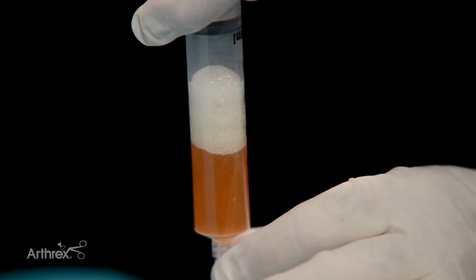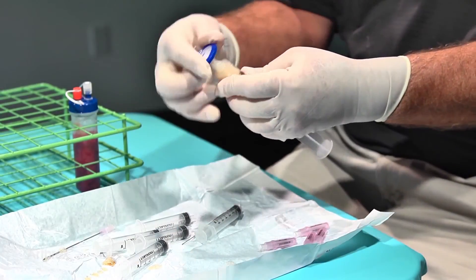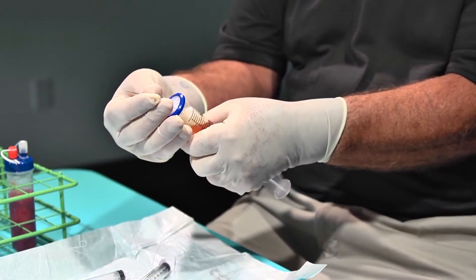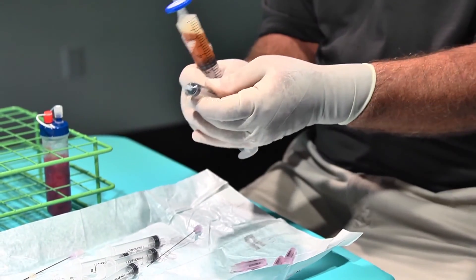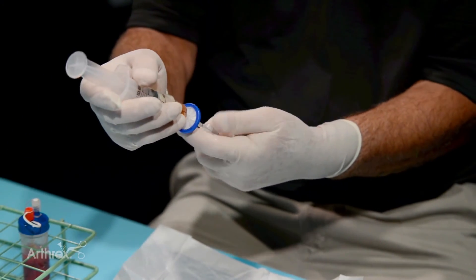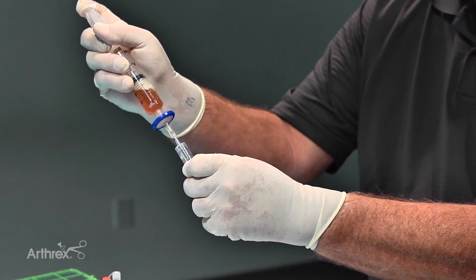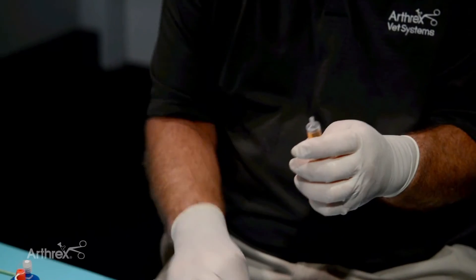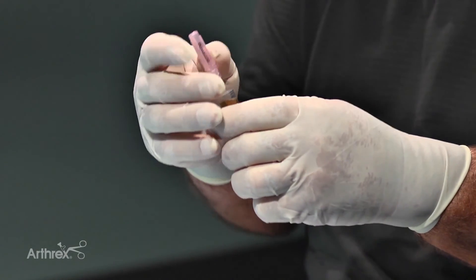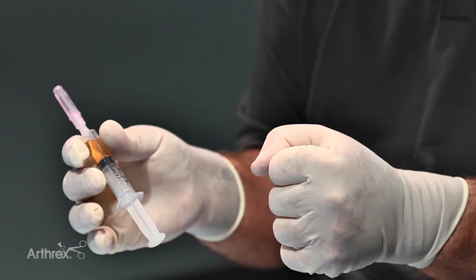In this case we get about 15 to 16 ml. We go ahead and hook up a millipore filter and a needle, and introduce it into individual aliquots of 4 cc's. We do this for as many doses as we get — in this case we'll get about four doses. We go ahead and cap them. We use them at the point of care, or we go ahead and freeze them, and you can freeze them up to one year.